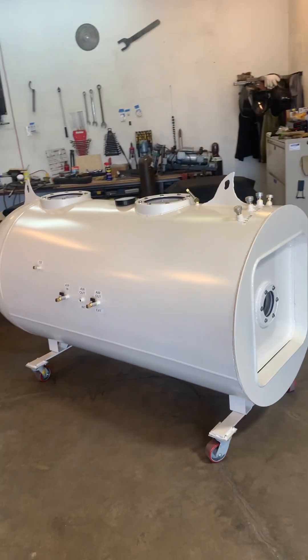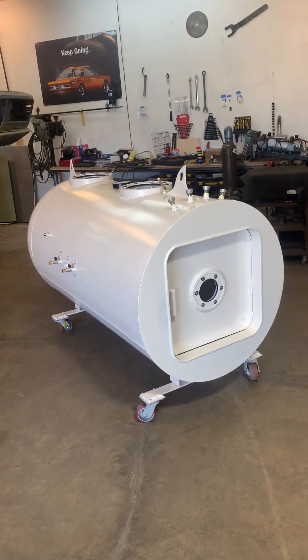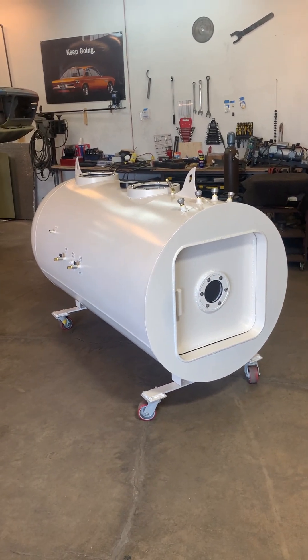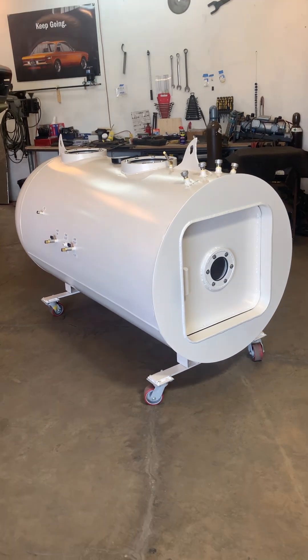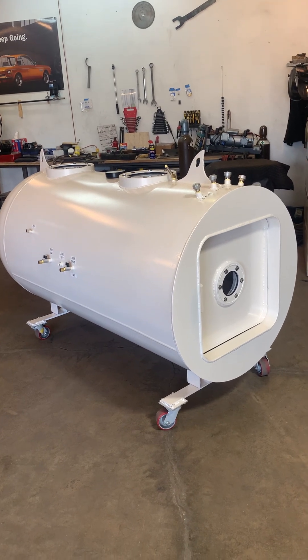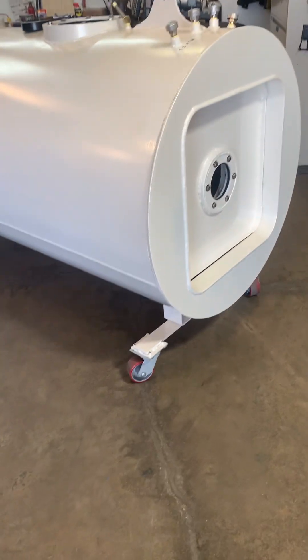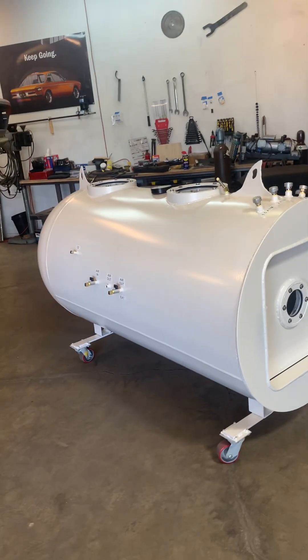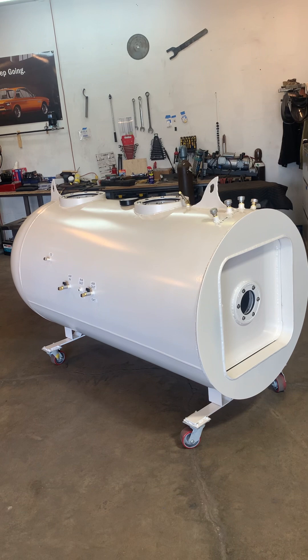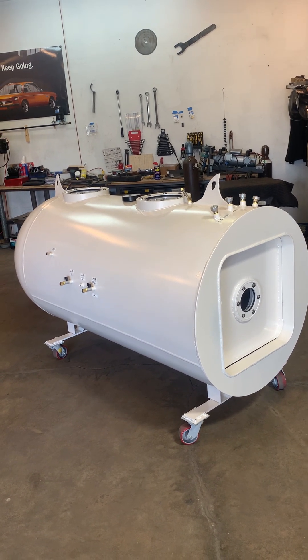It came back from powder coating and it's looking pretty good. We had to send it out without the wheels because when they powder coat, they go up to like 400 degrees baking on the powder, so these wheels would have melted. So we took them off, sent it over there, and just got it back today with the wheels back on.